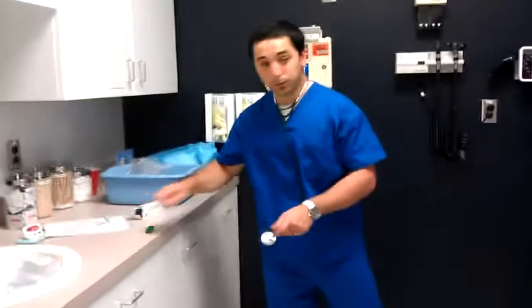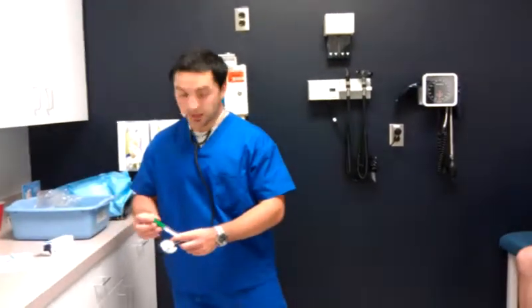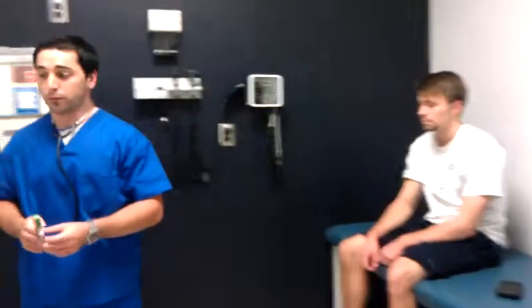And on the other hand, on another note, before, when you take this thermometer out, you must shake it to get it recalibrated. And then place it in the sheath, and then place it sublingually in the oral cavity of the patient.